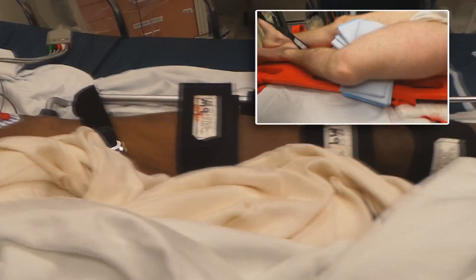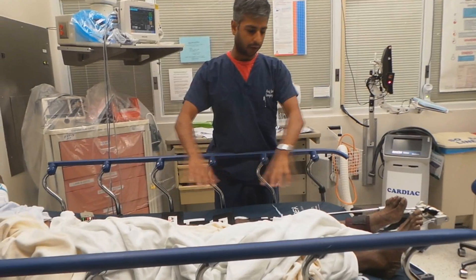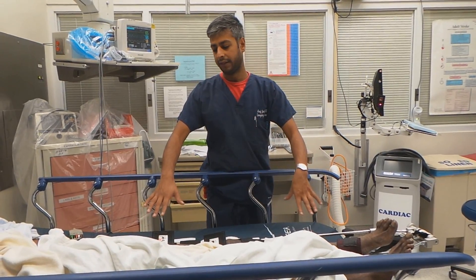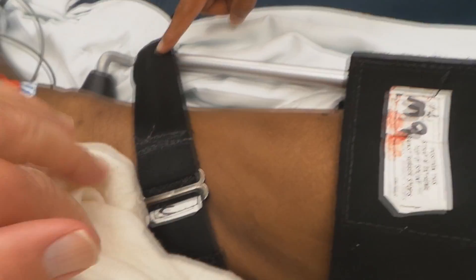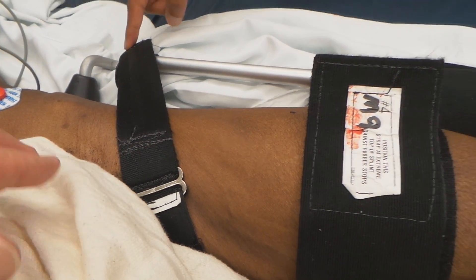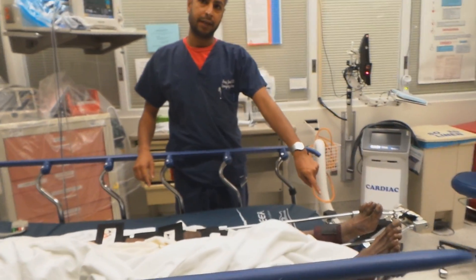The correct way to apply the splint is: first, measure it out against the good leg. Second, open up all the velcro straps. Then apply the ankle collar and slide it underneath his leg. First thing you apply is the high thigh velcro, which comes out from the medial aspect of his leg and over the top of his thigh. This is all done while a second provider is holding his ankle in traction.